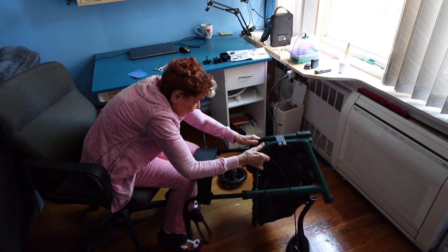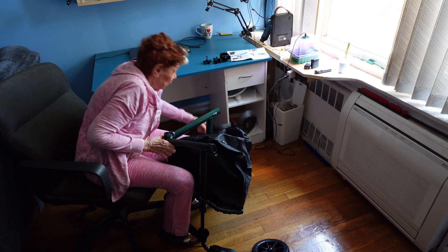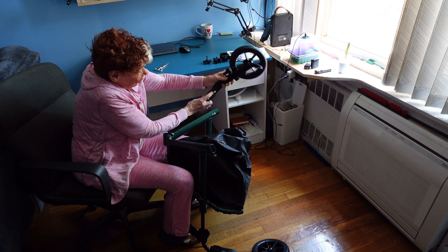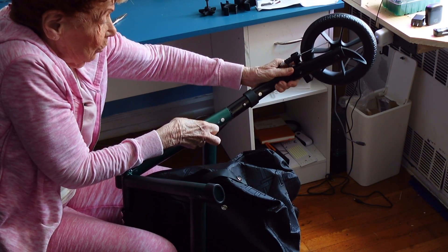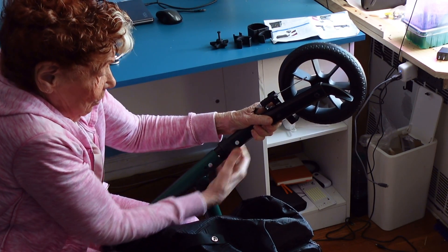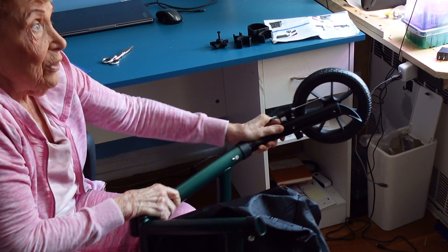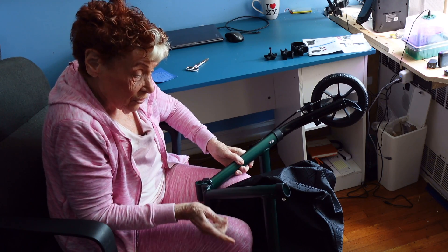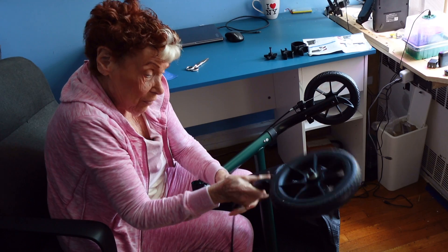Now we have to take the walker, turn it upside down, because we're going to insert the wheels. The wheel has a marking — left to left — and we're going to insert it in the slot. Press until it hits and now it's in solid. We're going to repeat it for the other side, and we're going to see that this one will say right for right.